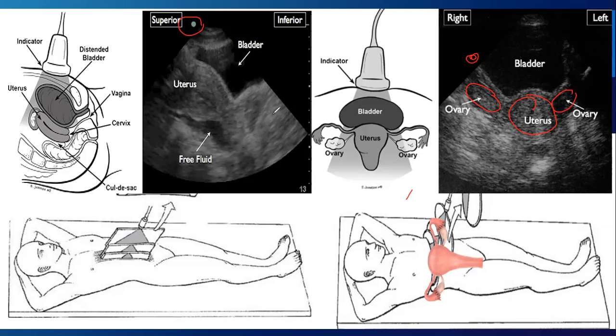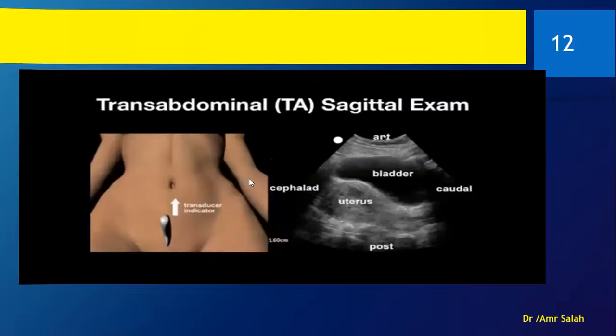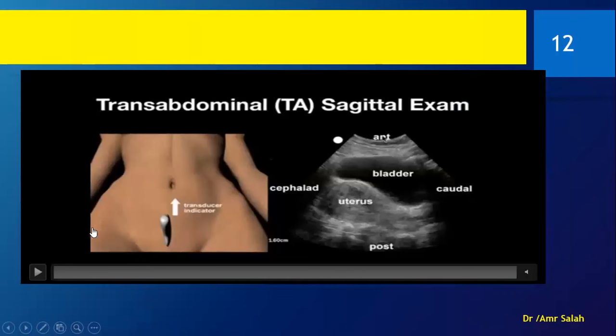It's of utmost importance to imagine the 3D rendering of the ultrasound. Of course, it is 2D, but we have to imagine the rest, all right? This is a very interesting video I've shared with you in order to see these views, real time. We'll start with the transabdominal approach, and here the probe is LS.